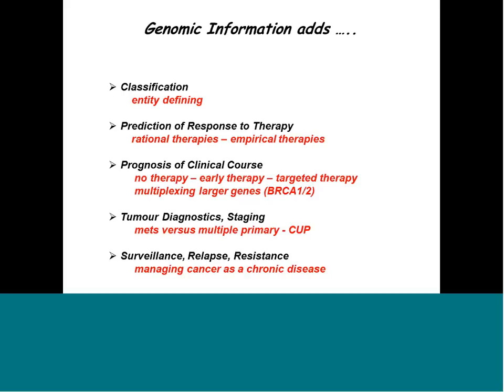We also need it for better tumor diagnostics, to survey the evolvement of resistance and relapse, but also to decide with very high accuracy what is the metastasis, what is the primary tumor, and what is a secondary tumor during the course of a long-term survivor of cancer.